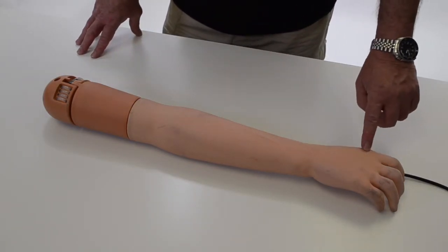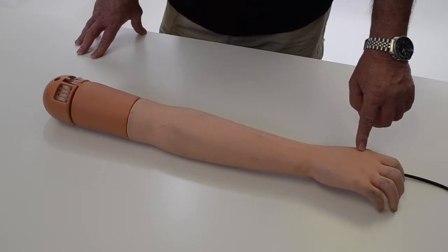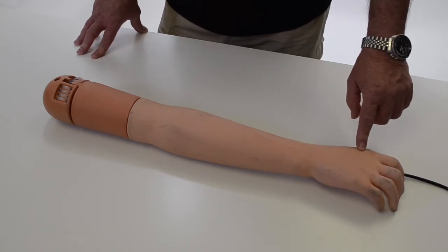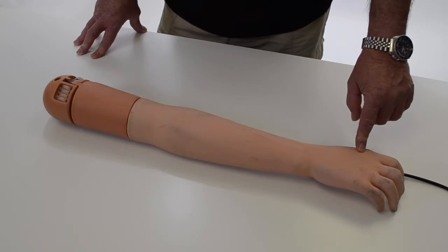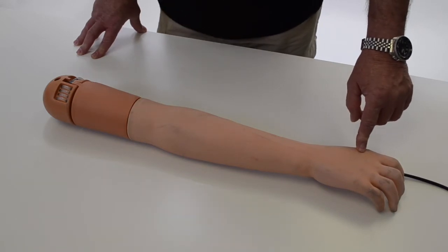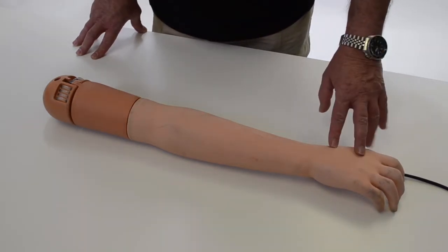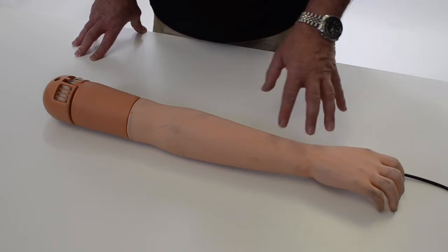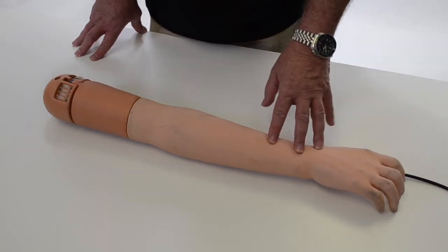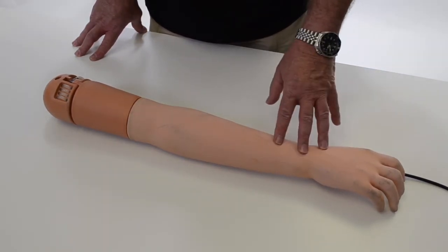With a syringe and a needle, insert and bleed off the air until you get all the air out, and then this arm is ready to be used. Maximum size gauge needles and IV would be 20 gauge.